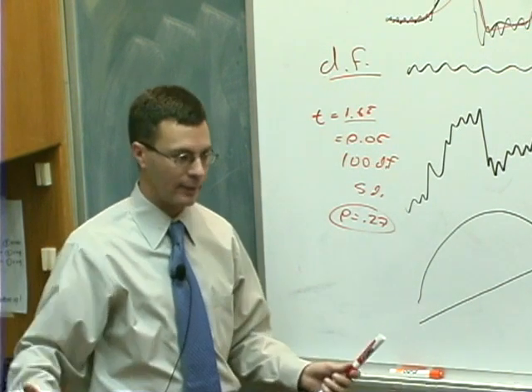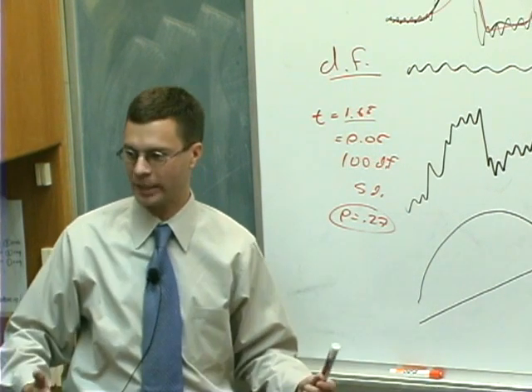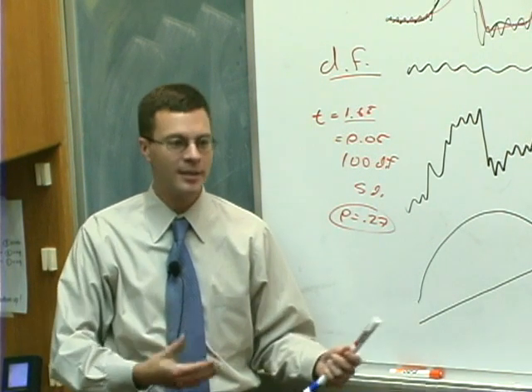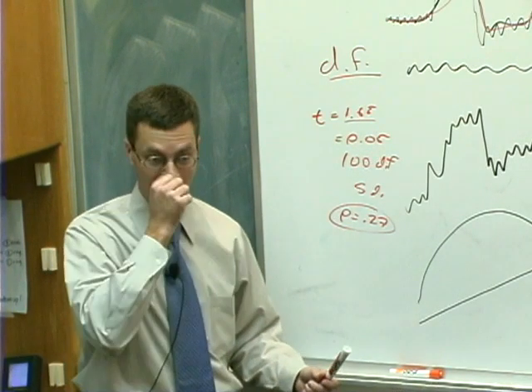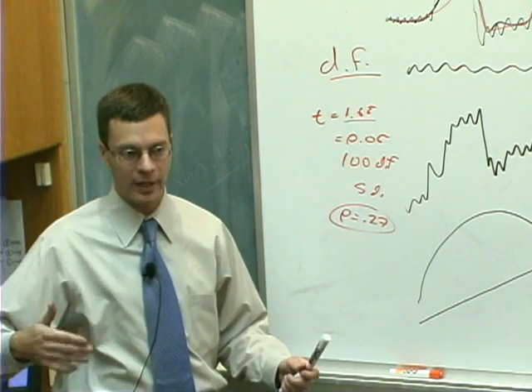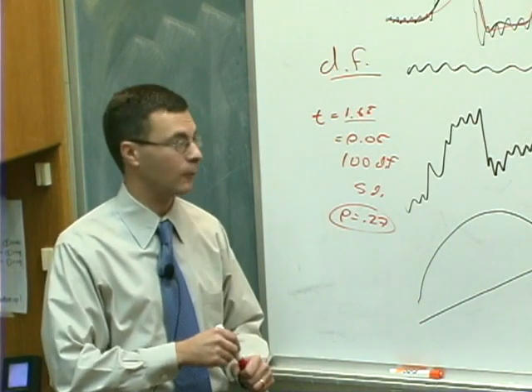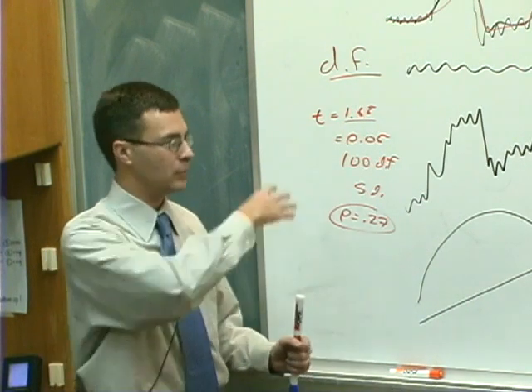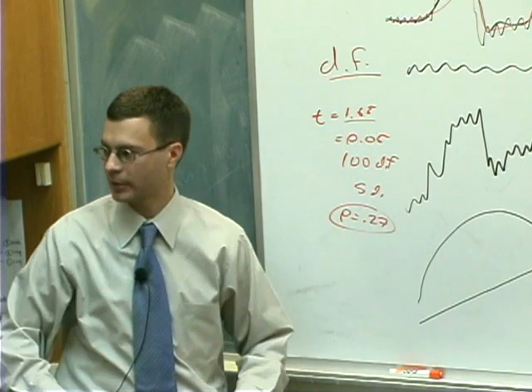But nonetheless, in fMRI experimental designs, we start off with an obscene number of degrees of freedom. Back in the old days when you would take these data to statisticians and ask how we should analyze BOLD fMRI data, their jaws would drop open at the number of degrees of freedom you have. 1,000 degrees of freedom is a lot of data to start with. So you can do a lot of filtering and manipulation and modeling of your data and still have a healthy number of degrees of freedom left for inference. To answer your question, the way that we account for the fact that we're shaping and sculpting the data is by making these adjustments. And you can show that you still maintain an unbiased statistical test at the end of the day, even after you do these things.